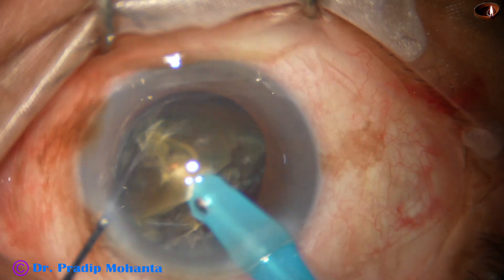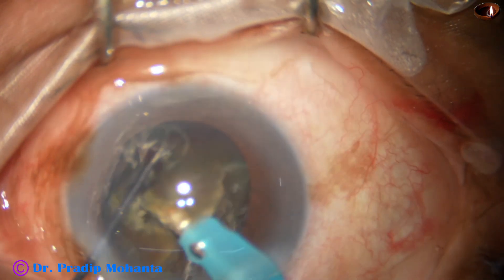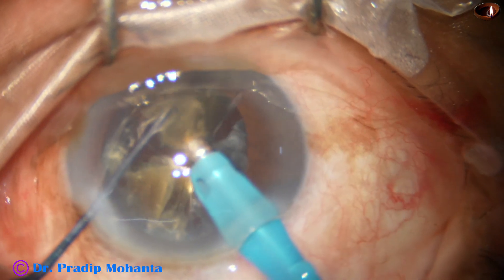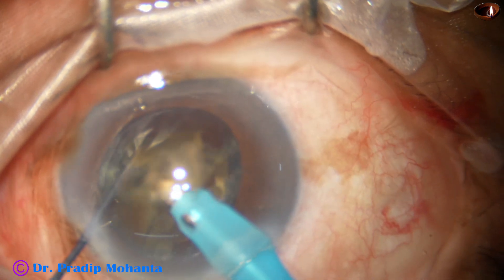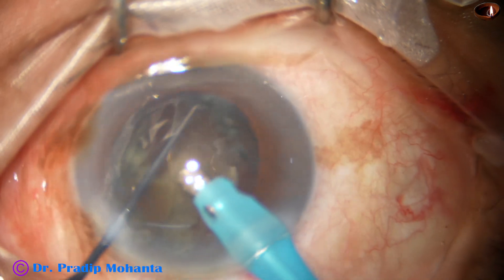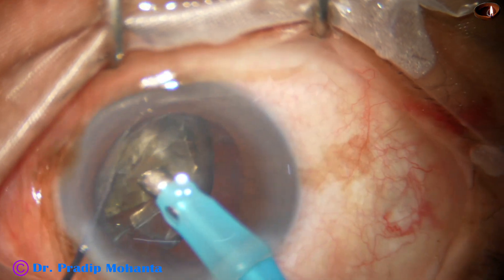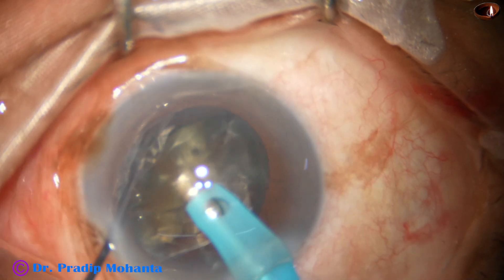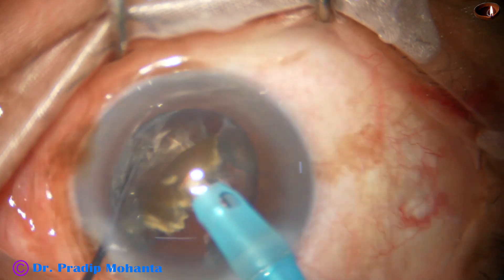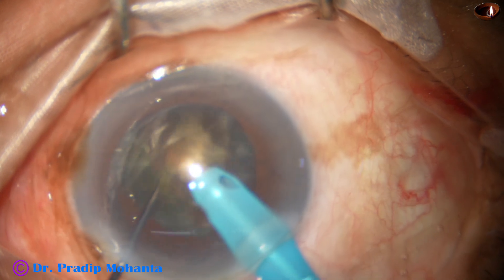This epinucleus shell acts as a contact lens and protects the posterior capsule. This is the other heminucleus — it is subdivided into two large fragments. One heminucleus is held at the apex, its epinucleus shell is detached, and it protects the posterior capsule. This is the last nuclear piece — holding the nuclear material, detaching the epinucleus, which is protecting the posterior capsule.